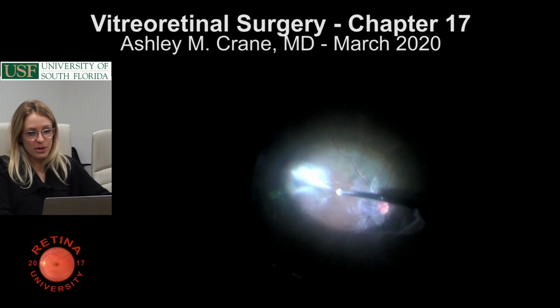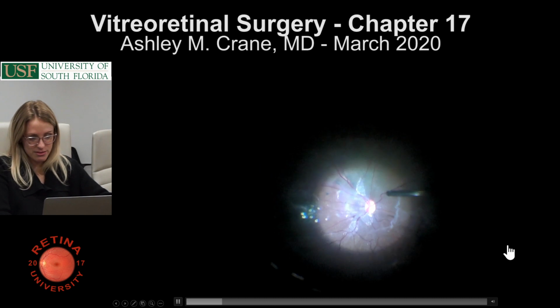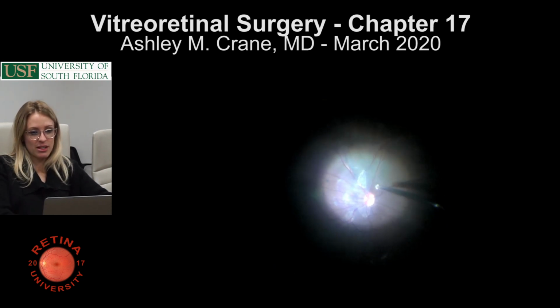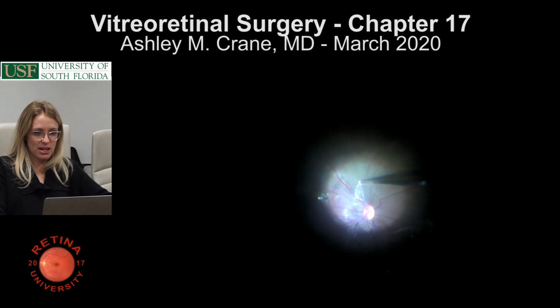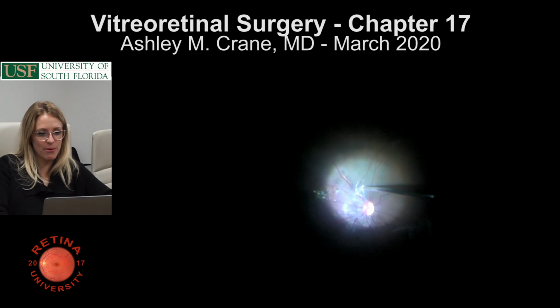So there's off superiorly, and then you're going to take it nasally, or you kind of work your way around. So okay, then you're going to cut some of it, and you might keep lifting. This is after you've done your core vitrectomy? This is, yes, effectively yes. Patient is not detached, but it's having surgery for something else. Or maybe they are detached in the periphery that I can't see right now.